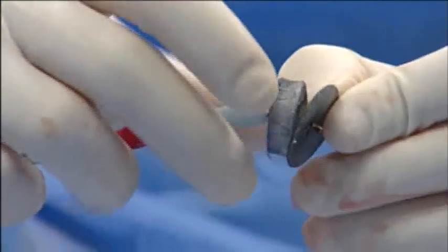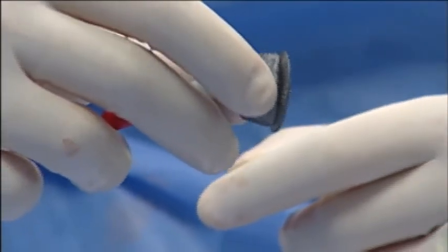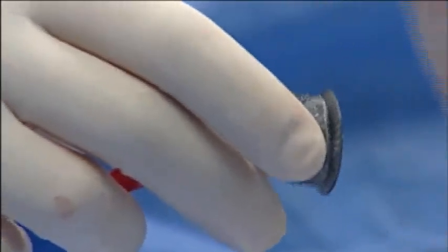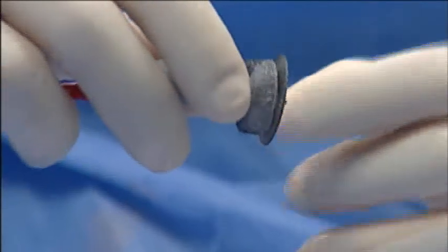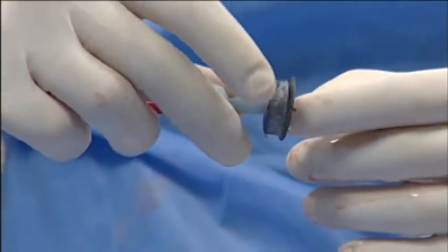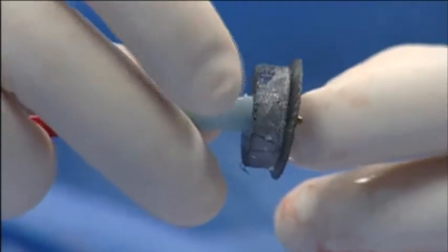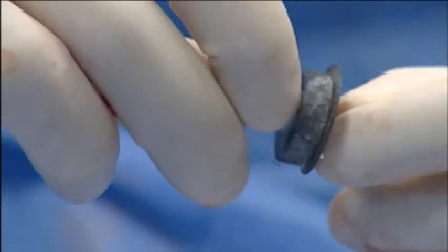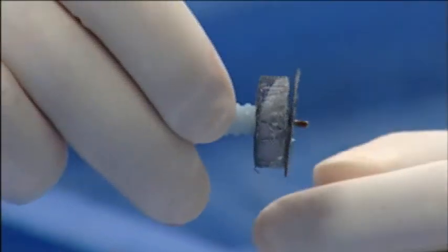So the ACP stays in its place because of some radial force. It's going to be squeezed by the left atrial appendage, the landing zone, usually about 1 centimeter inside of the left atrial appendage, taking into account the mouth. And of course, it's going to be stabilized by these stabilizing wires too. So that's the mechanism of stabilization of the device, okay?